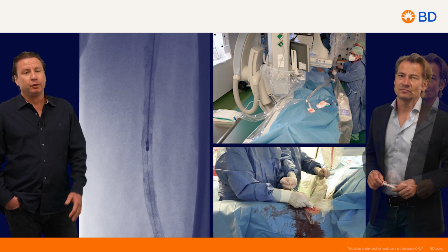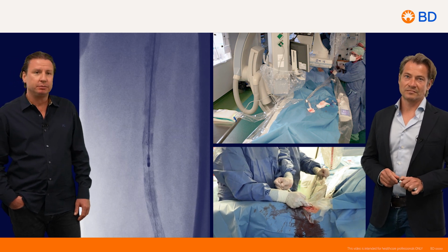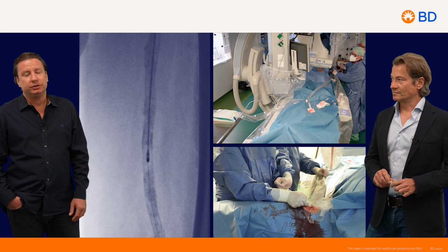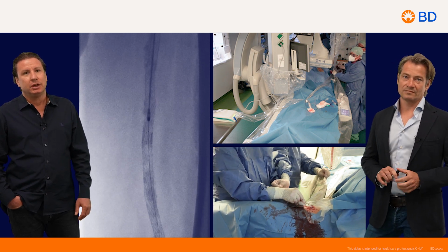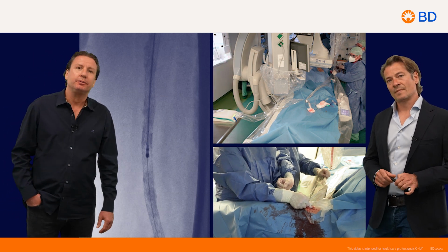Of course, we prefer the left brachial artery, so the distance is definitely shorter compared to the right brachial, and you don't have to go completely through the arch. So this also potentially avoids complications.